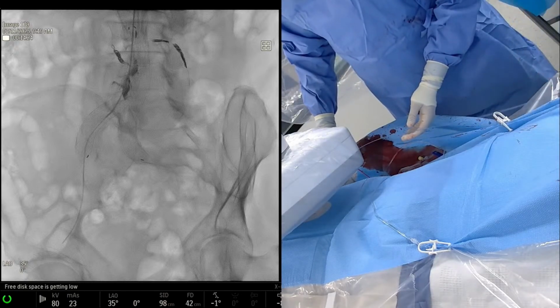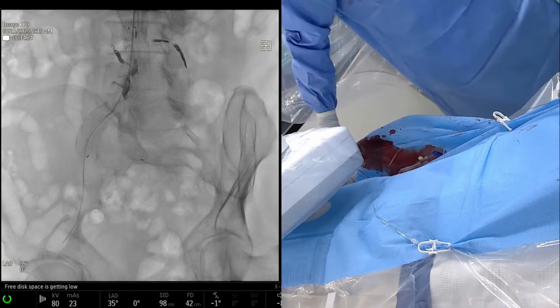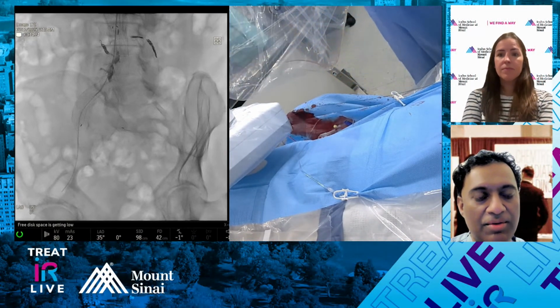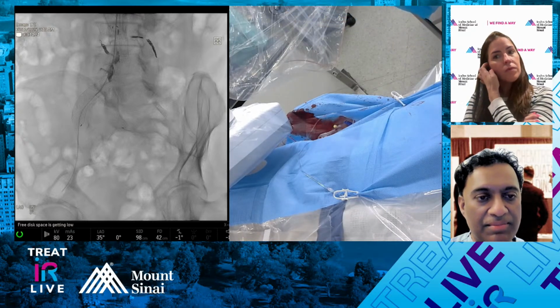So now obviously the... Well, yeah. Go ahead. Sorry. Sometimes with the limb of the graft, it can be tricky to cannulate the ipsilateral internal, depending on how low the limb is or how angled it is. So it's sometimes a little tricky to get in, either from an ipsilateral approach or even probably from a radial, from an angulation standpoint.